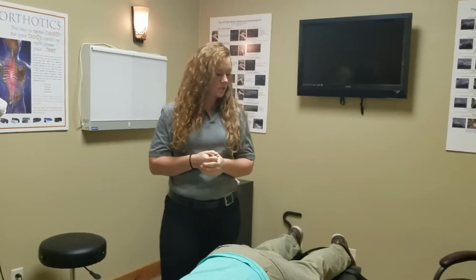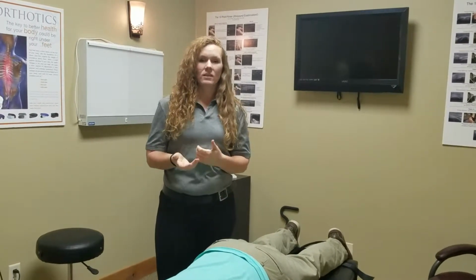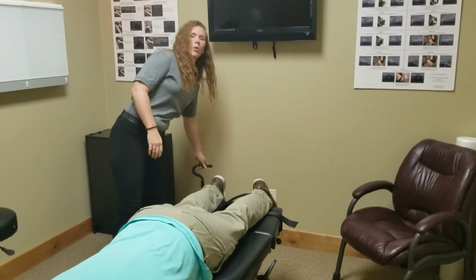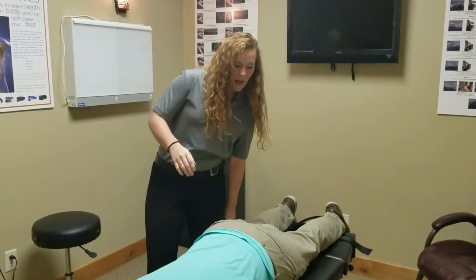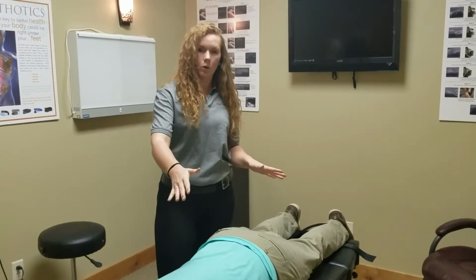This morning I want to demonstrate for you guys a technique that we do in the office called Cox Flexion Distraction. It was invented by a man named Dr. James Cox, and that's why it's named that. With this technique, the table is actually going to split open, and it's going to flex forward and extend back up.